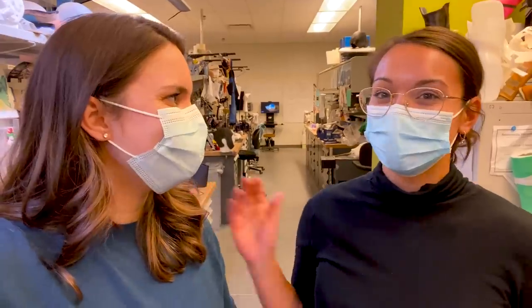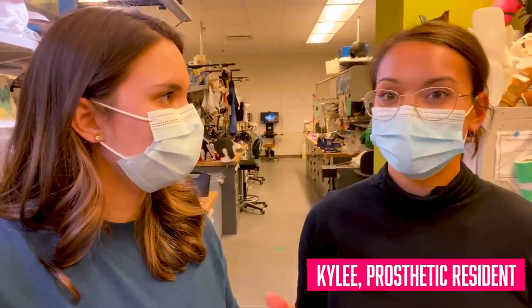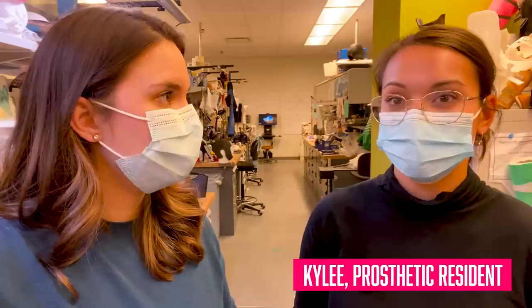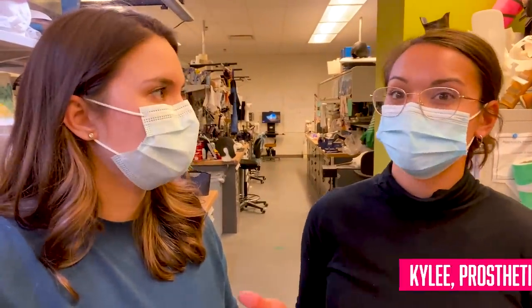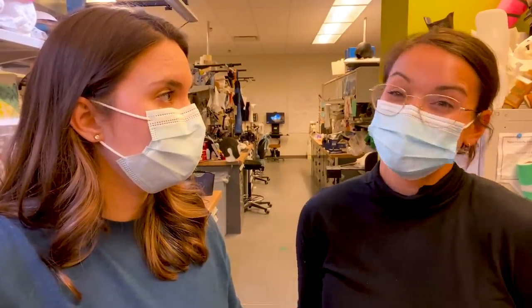Isn't this incredible? I'm just completely blown away by this technology. It's so exciting. So I just assumed that everybody would want a myoelectric device over a conventional prosthetic. But apparently, that's actually not the case. It definitely has its cool factor, and it's really interesting to learn about and see. But in reality, not everyone is a perfect candidate for these, and they're not the best option for each patient. So they're heavier, and so sometimes that means you wear it less.